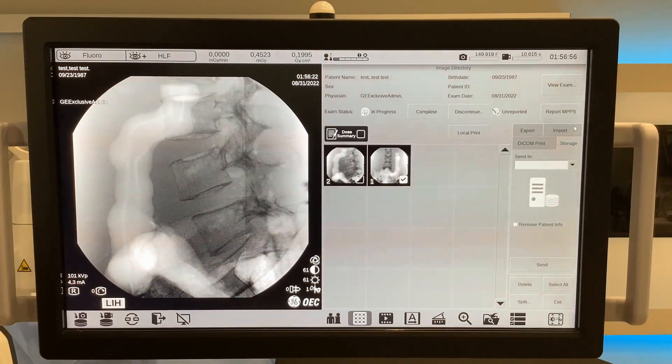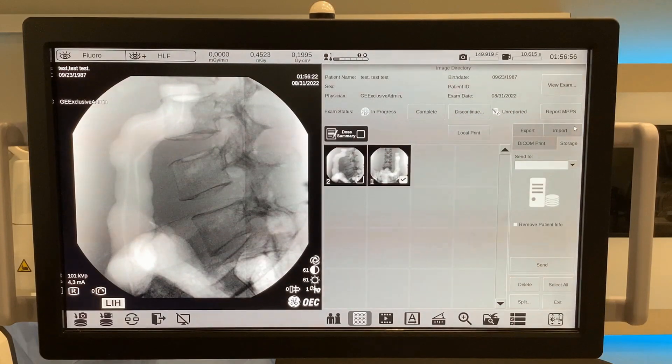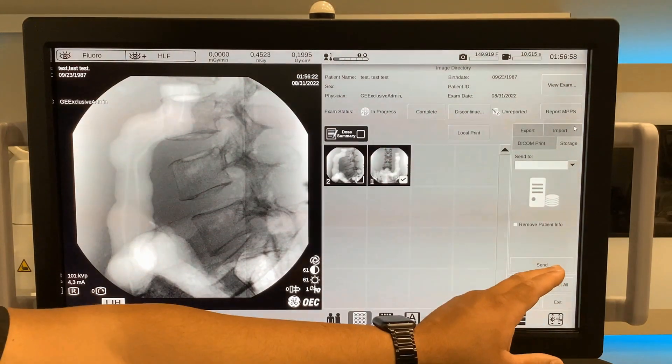If the system is configured with the PAX, DICOM, or other archival system, select the storage tab. The configured location will appear under the send to area. Make sure the desired images are selected and select send.